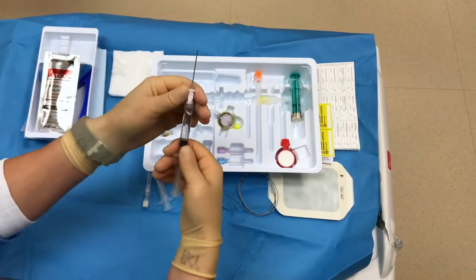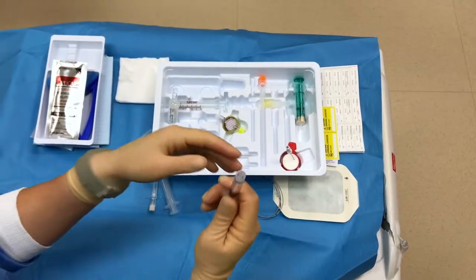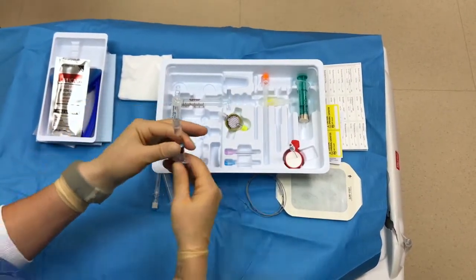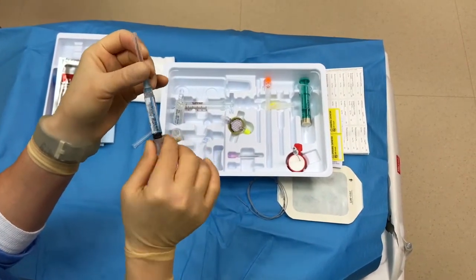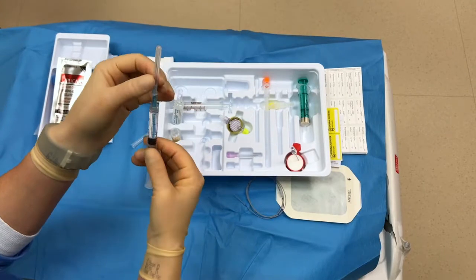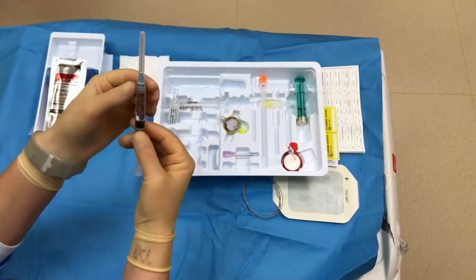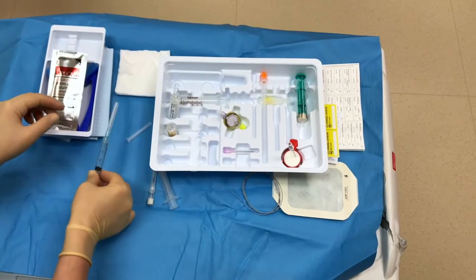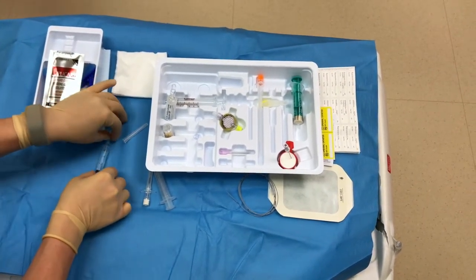Can't get enough lidocaine. Take any needle tip that you discard, put it into your sharps needle holder. And then you use the blue tip needle, that's going to be for injecting our locals. So you can see that the needle is obviously much smaller. I typically just leave it a little bit loose and set it down so that way when I take it out I can easily withdraw the needle.